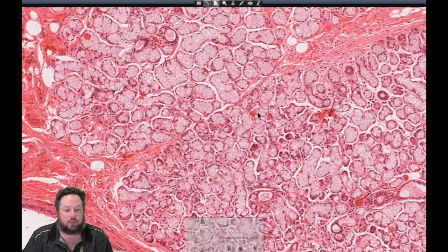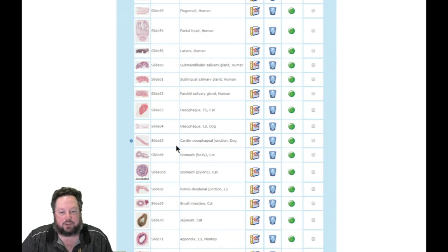Now, before we move on, does anyone have any questions? We are starting to head towards the end of the stream. We've got about a quarter of an hour left before we have to close down, and this computer's going to close down just a little bit after that. So we might move to the esophagus, unless anyone's got any questions there. All quiet in the chat, so hopefully that's a good sign.